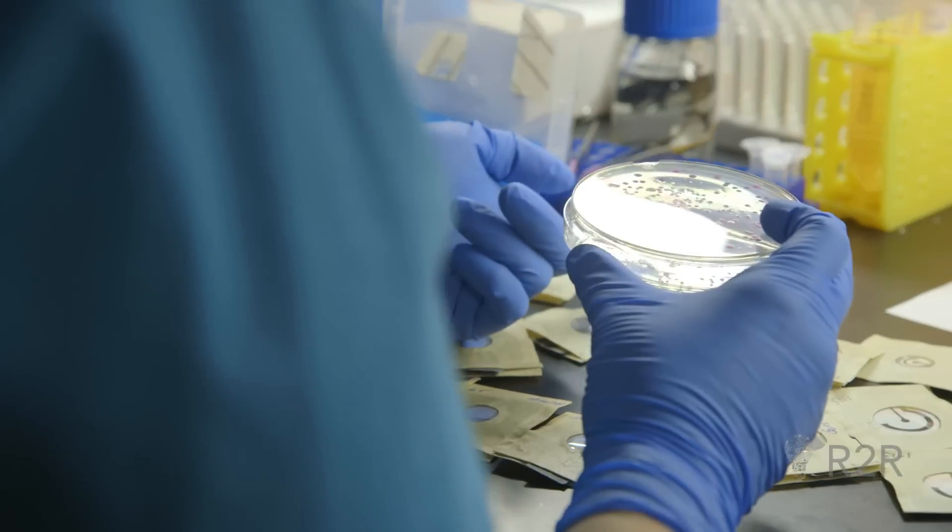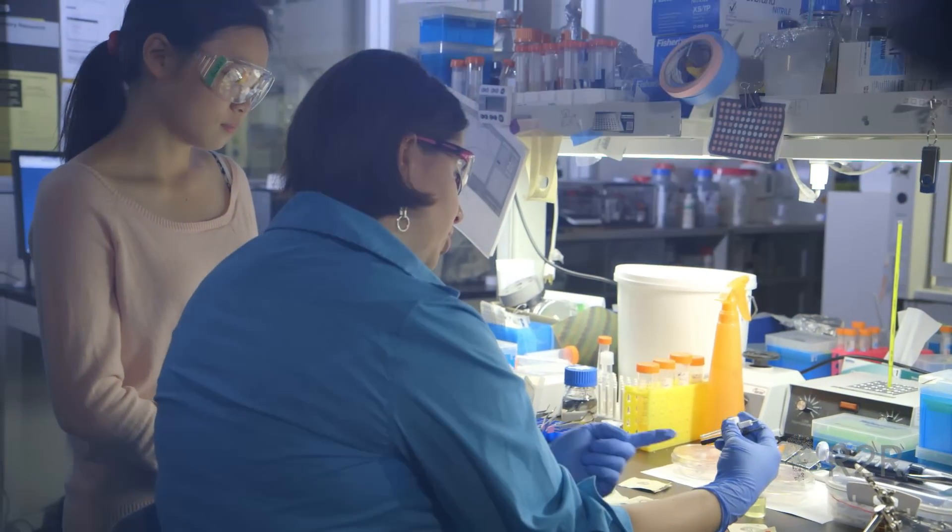What really excites me is to have developed something and to have a tool or something applied. I like to have something concrete to show someone and say, this is what I did today — I mixed paper, I mixed some chemicals, and now you have a platform that will allow you to detect E. coli in milk so you will not get sick.